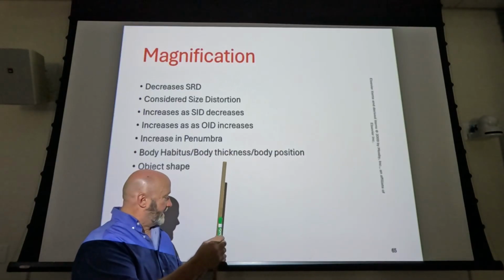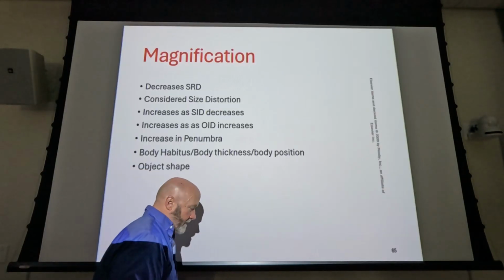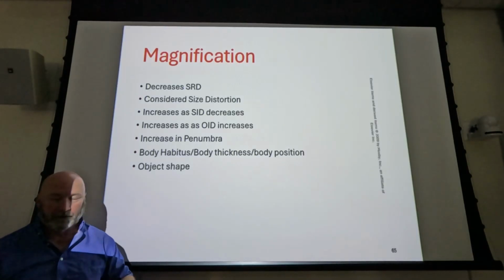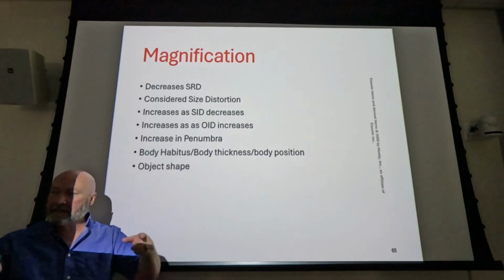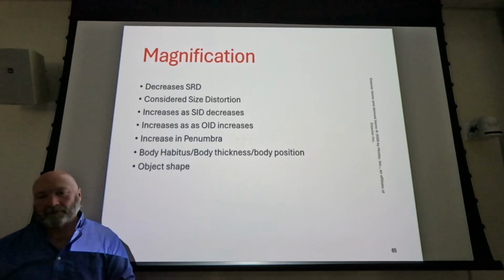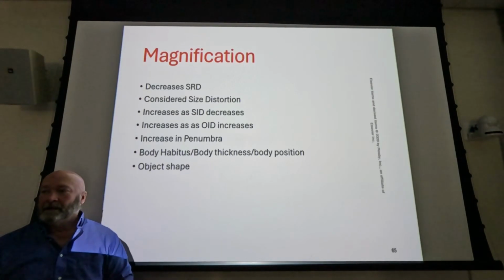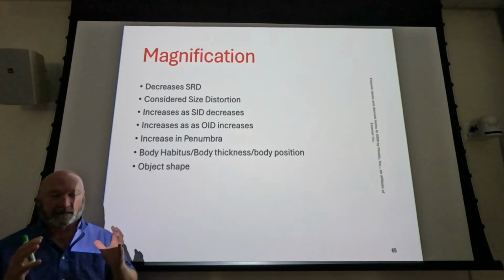If you happen to see the abdominal aorta, let's say you're looking at your scout image and you kind of see the kidneys and you see the bladder, you know where you need to center. You see the vertebra and you've got something sticking out on both sides of the vertebra. Very few things that could be. Maybe the patient has a mass right at midline, but they could have a bulge in that aorta. What do we call that? That's an aneurysm. Now you inject 100 cc, you increase their blood volume by 100 cc's and they've got this massive aneurysm.